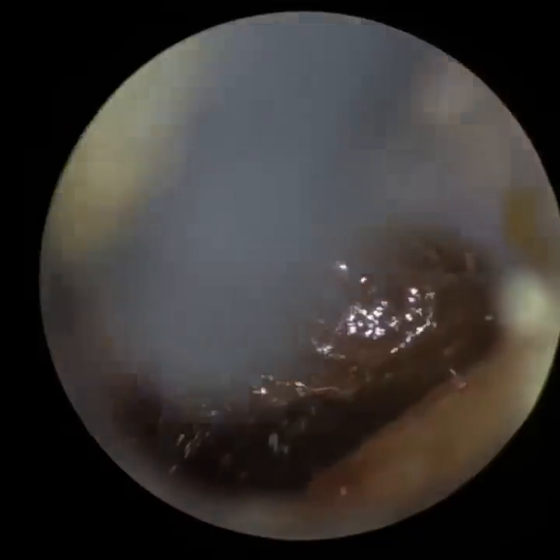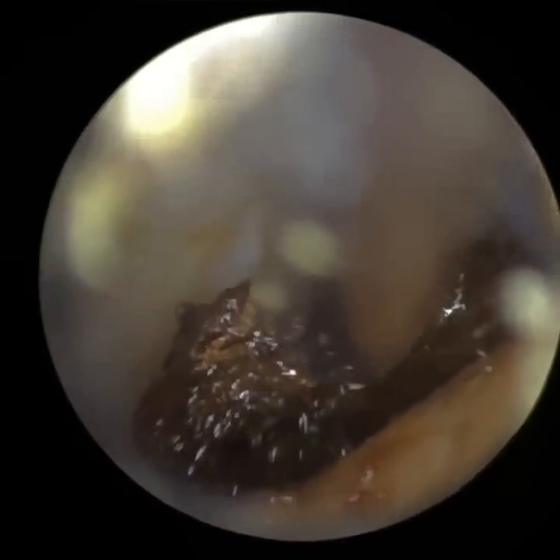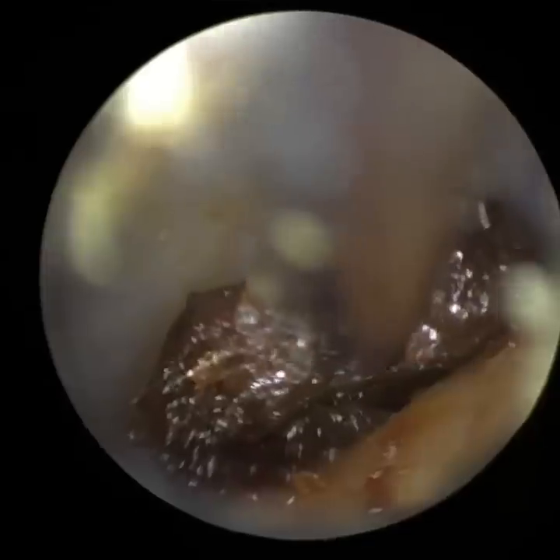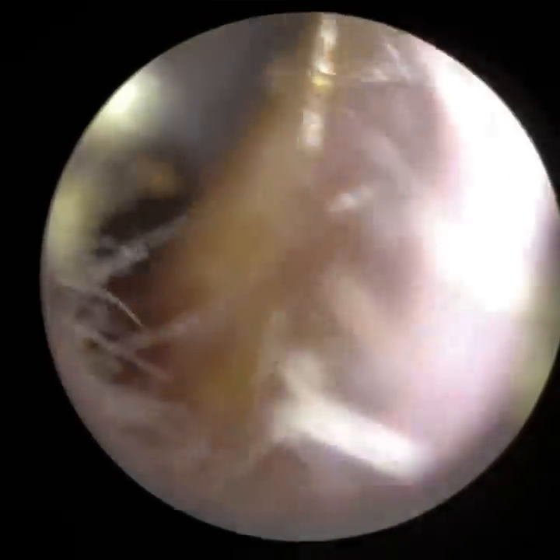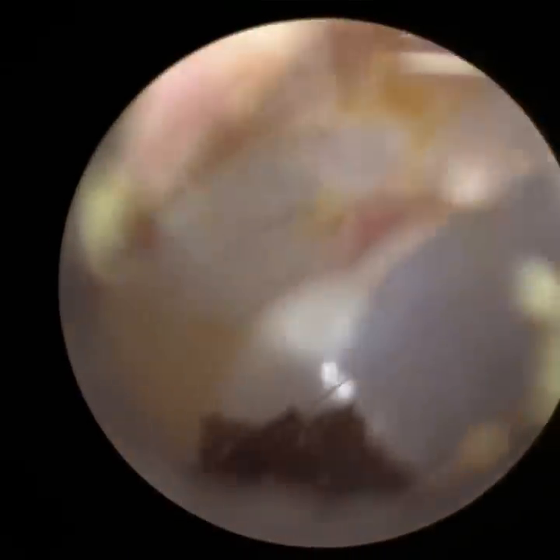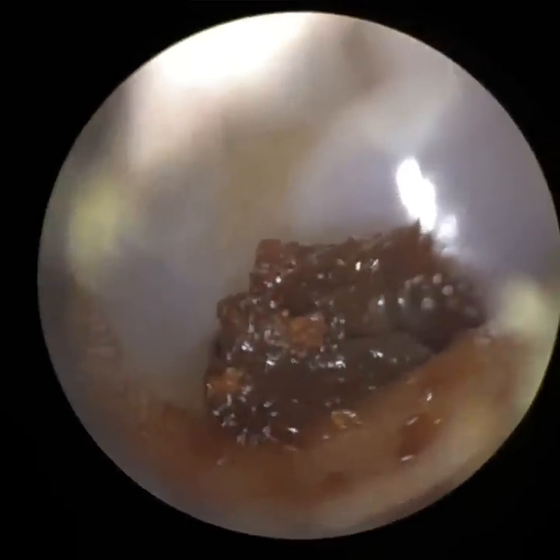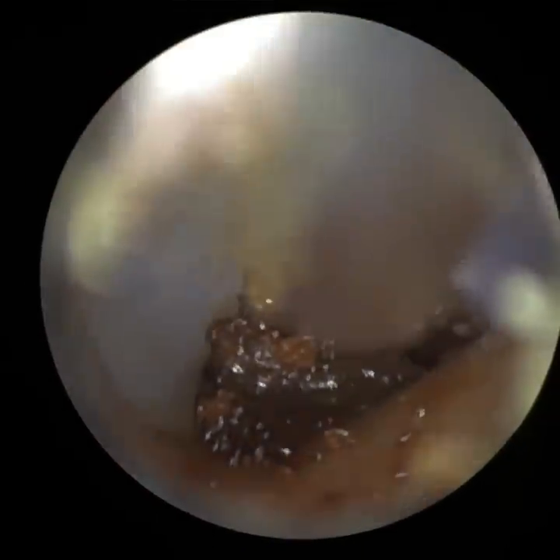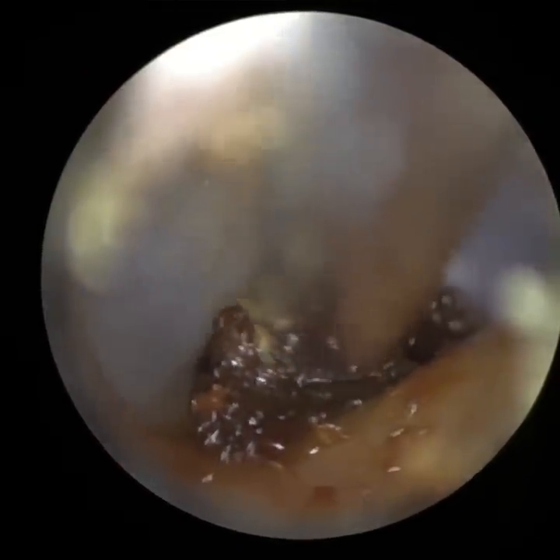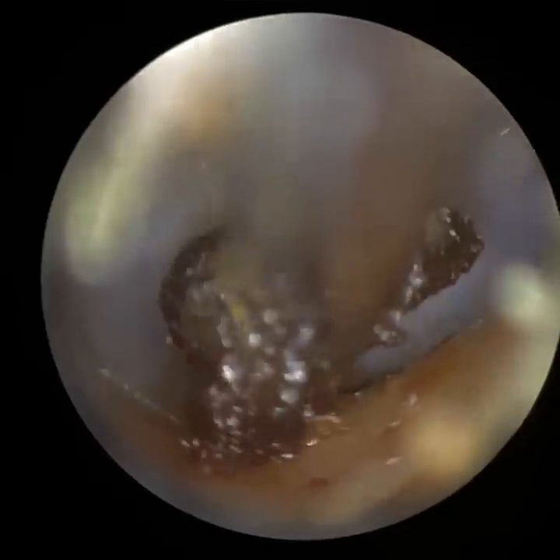Prior to the endoscope, I used to use head loops, and I just wouldn't be able to visualise detail like this. I wouldn't be able to remove wax very deep from the ear at all. With the head loops, if I'm honest with myself, I would only possibly manage to remove it from the midsection of the ear — anything else, the magnification and clarity just wouldn't be there. It's a bit softer, this wax. I was hoping that piece I just attempted to remove would come out in one segment, but it didn't. It's just in the inferior recess — as I'm suctioning it, I'm going up.